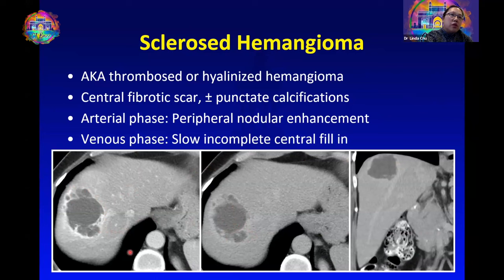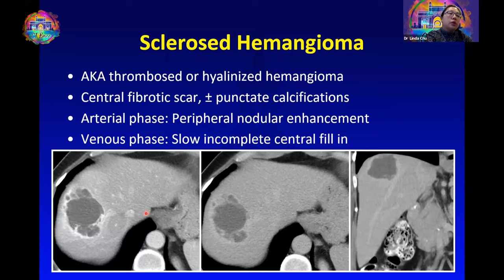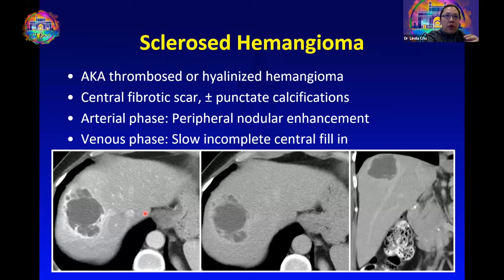Sclerosed hemangiomas have a more atypical appearance and can be difficult to diagnose confidently, especially if a patient carries a diagnosis of malignancy. Usually MRI is performed, and even on MRI we may not be sure, but there are reassuring characteristics like a very T2 bright lesion and peripheral enhancement with progressive fill-in. Usually serial follow-ups are needed to be confident about the diagnosis.